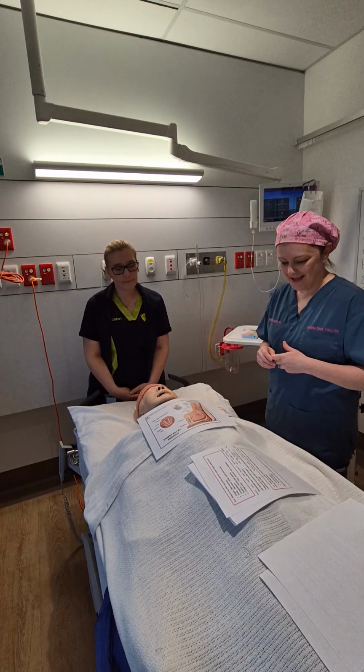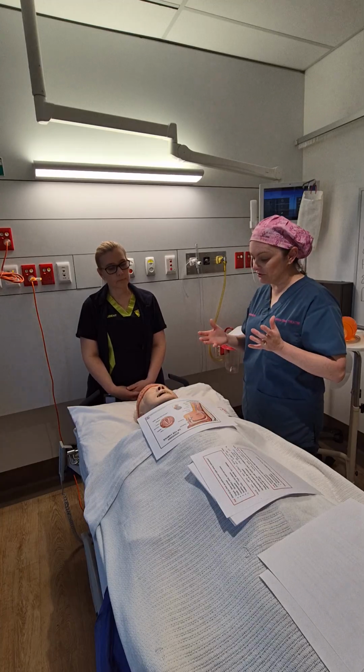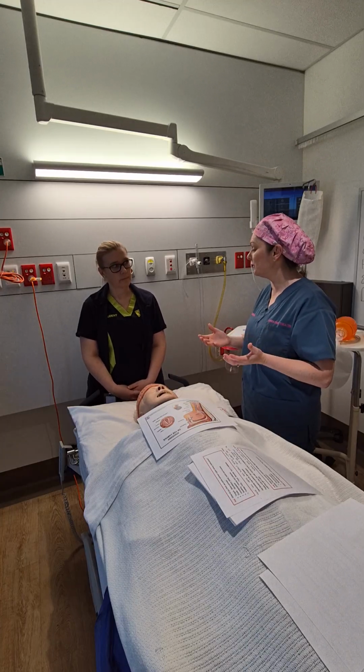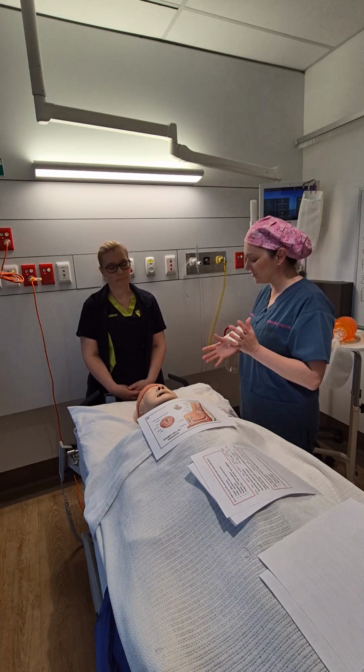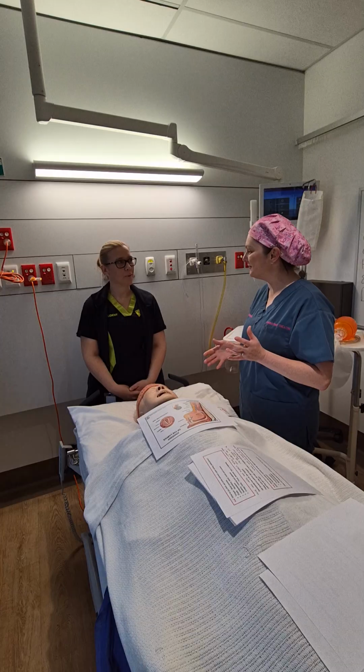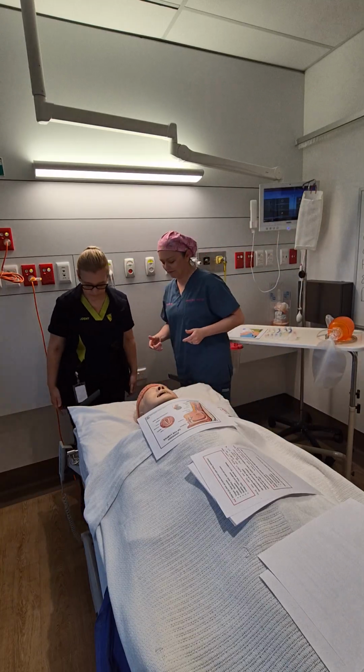No problems. So to stop the airway obstruction, in particular the tongue, we'll do some jaw support. So have you ever done jaw support on anybody before? I haven't. No? Practiced on a mannequin before? Yeah, a long time ago. No problems. Alright, we'll just go through the start then. So I'm just going to push you over a little bit if that's okay.